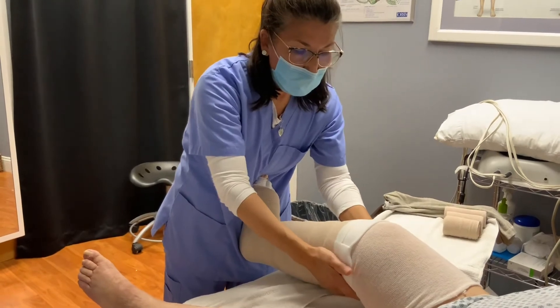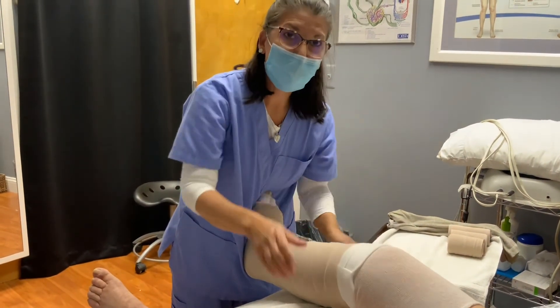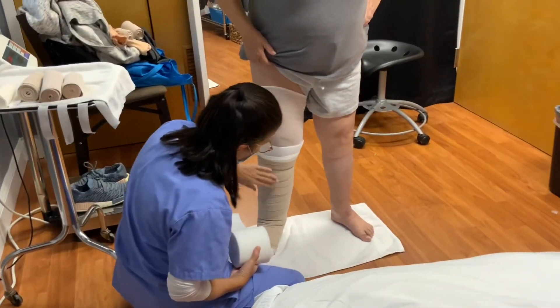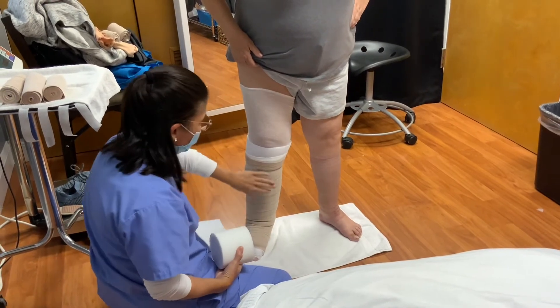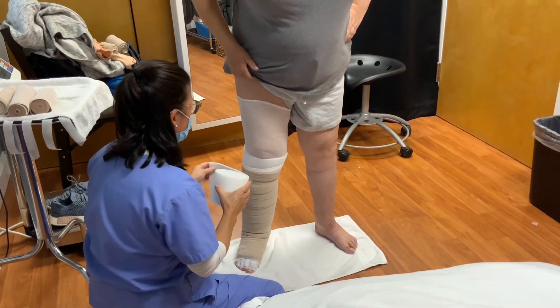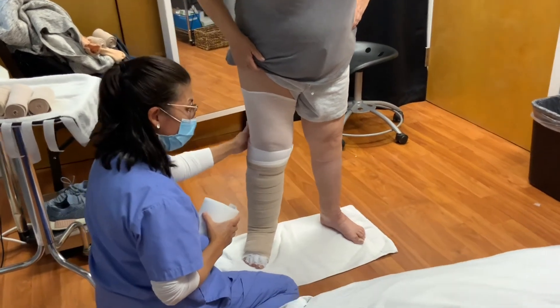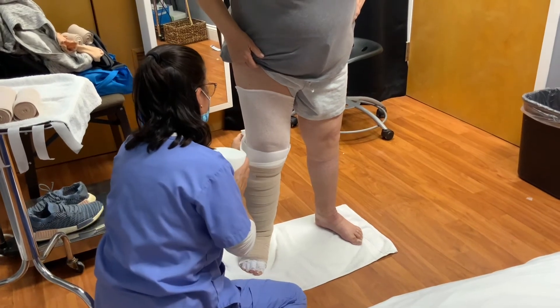Now we're going to go to the knee level and the thigh. We've covered the foot with foam, and used the comfort foam for the lower part. Now we're going to do the same thing in the upper thigh area. Remember, we have doubled in the back so that there is some cushion — so when there is bending, the bandages are not digging in.